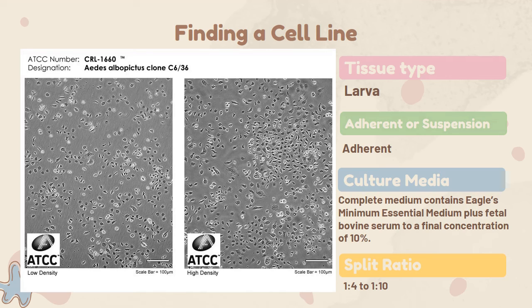A sub-cultivation ratio of 1:4 to 1:10 is recommended. This is to ensure that in one flask of cells, it will take about 4 to 10 days before they reach 80% confluency, and when they are subcultured, they can produce up to 4 to 10 flasks of cells, and these subcultured cells can ultimately reach 80% after 4 to 10 days of their subculturing.